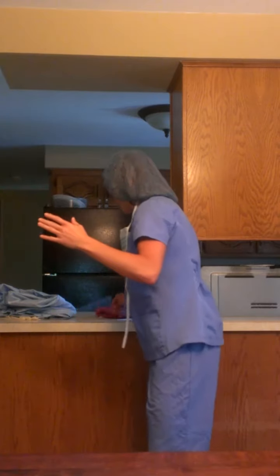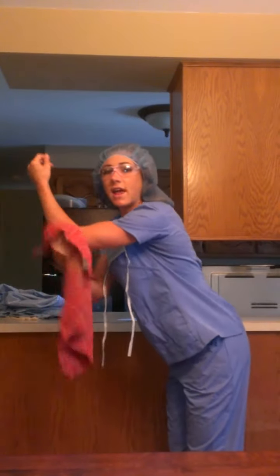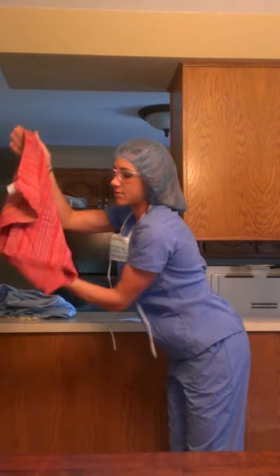After you've rinsed them off, you let them drip dry. Prior to doing this, you have placed a sterile towel behind you. So once you've got it mostly drip dried, you turn around, you grab that sterile towel, you just pinch it, and you slightly bend over and simply pat up and down your arms, just like so.